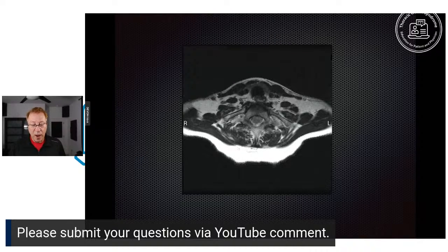The fat is white, the muscles are dark gray, the brachial plexus on each side is medium gray, and you can separate it. You can see the bones of the first ribs. You can see into the spinal canal. You can see the spinal cord. I can see the thyroid gland. I can see small lymph nodes. It's great at soft tissues.